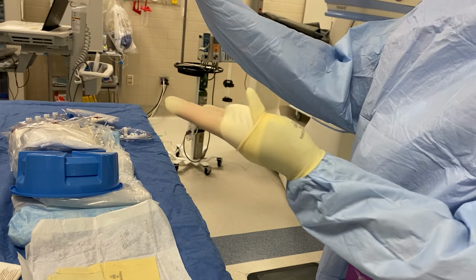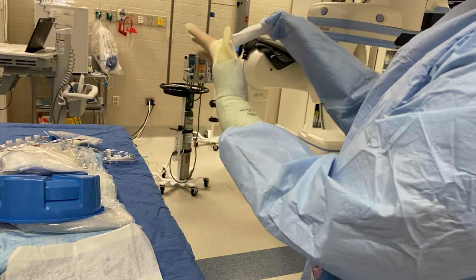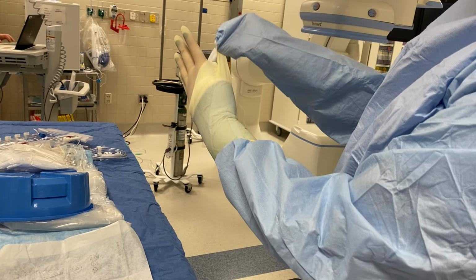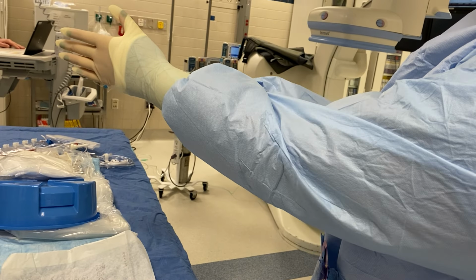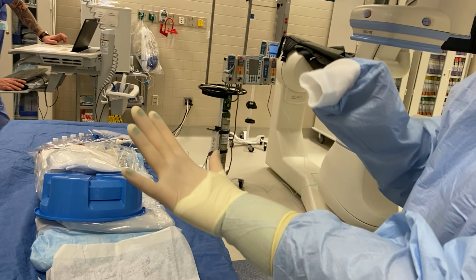And then, still keeping my hand inside, I pull the glove down. To get my thumb in, I just pull the thumb, and then I can pull the sleeves back and it'll pull the glove on nice and tight.